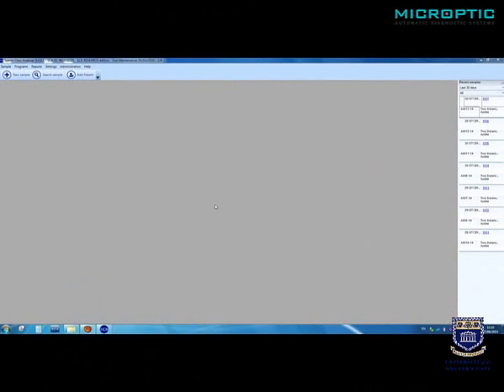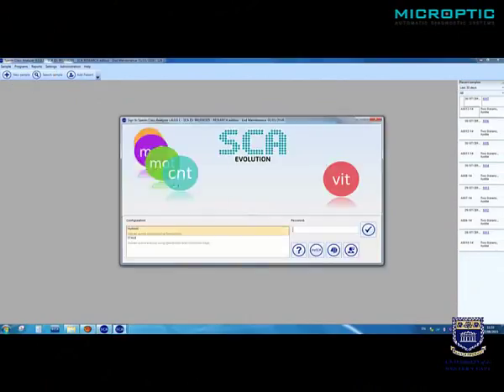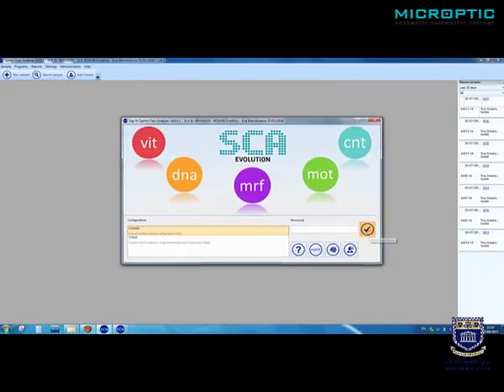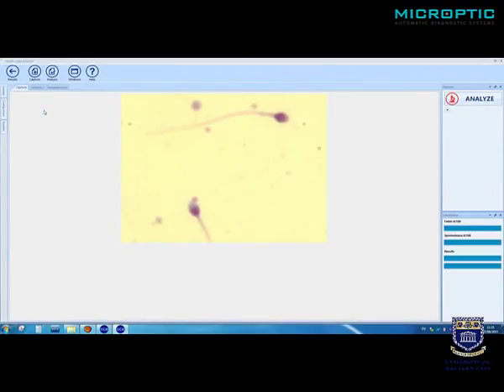We're going to show you how to do a proper morphology analysis from Sperm Blue stained slides. Okay, we're just starting the programs again, and this time just a very brief review of sperm morphology. We again select the correct configuration for human, and we can start directly analyzing as we have already set up the configuration nicely. We're focusing there on sperm stained with Sperm Blue. We analyze.